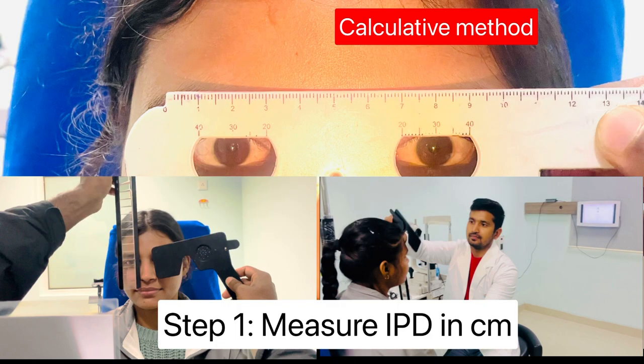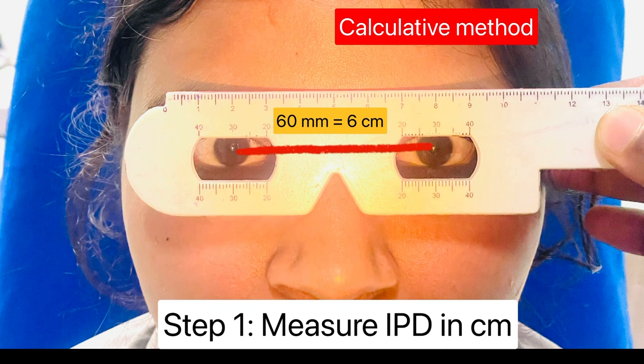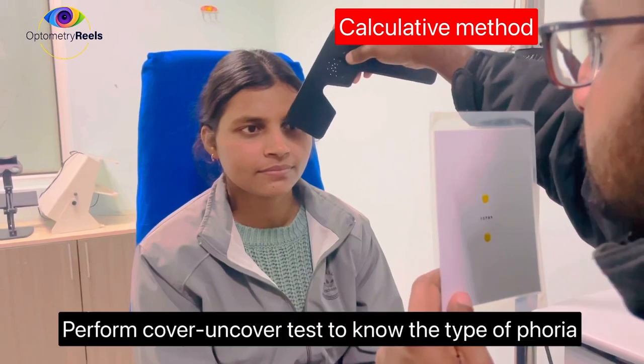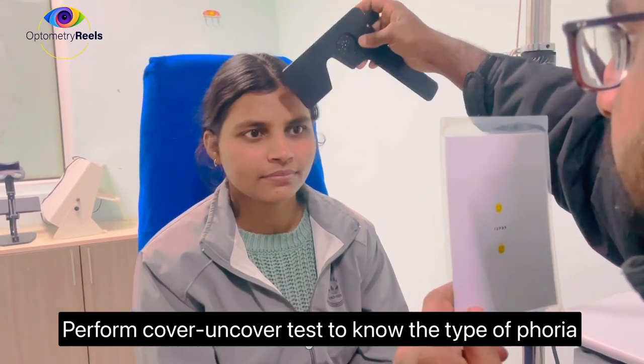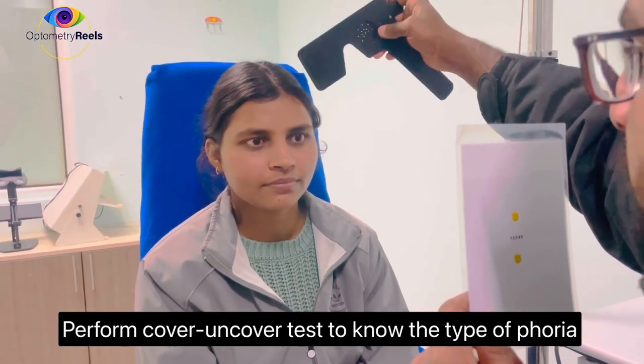Thus the calculated method for AC/A ratio can be understood in three steps. Step 1 is to measure the IPD in centimeters. Now perform cover-uncover test to find out the type of phoria.